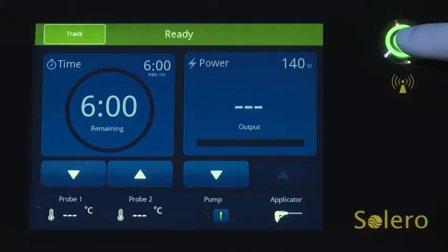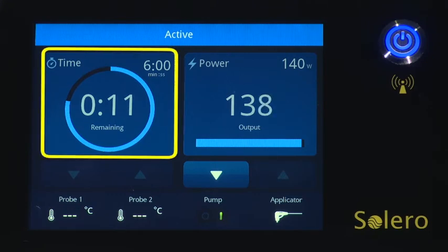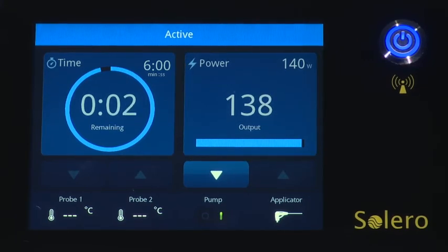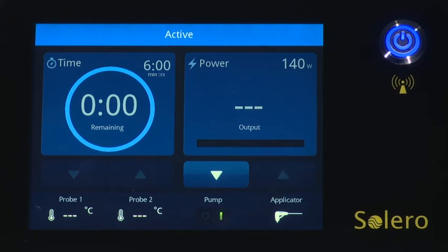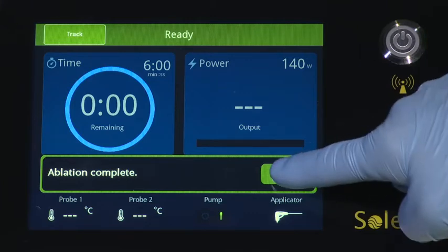Once ablation time and power settings are set, the system can be activated by using either the foot switch or the microwave power button on the upper right side of the generator's front panel. When microwave energy is initiated, the button will turn from green to blue and the top indicator bar of the screen will switch from ready to active. The timer will begin to count down from the set time to zero, and the output or delivered power will be displayed to the right of the timer. When the timer reaches zero, power delivery is automatically stopped and the system reads ablation complete and returns to ready mode.